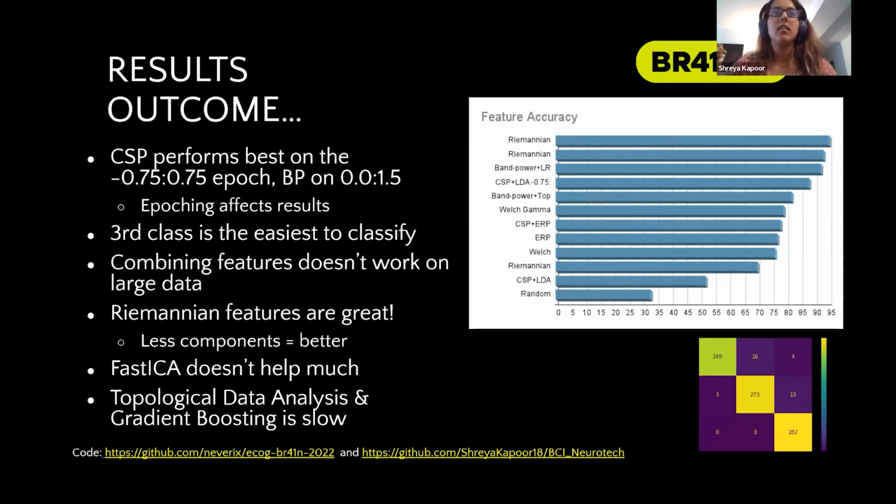And also when we had the evoked responses, the paper mentioned that they took a window of 0.75 seconds on the stimulus onset, to have a sliding window around this stimulus presentation. So we also used this in our model, and we tried different possibilities for this parameter, and this really worked well when we put it into cross validation classification.